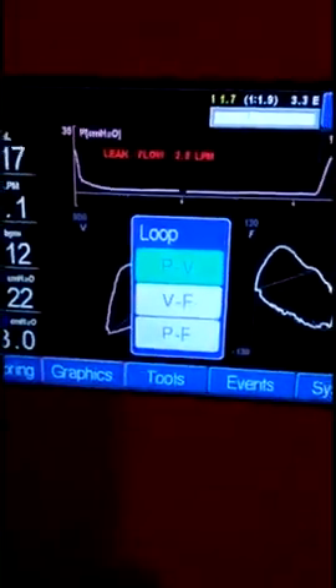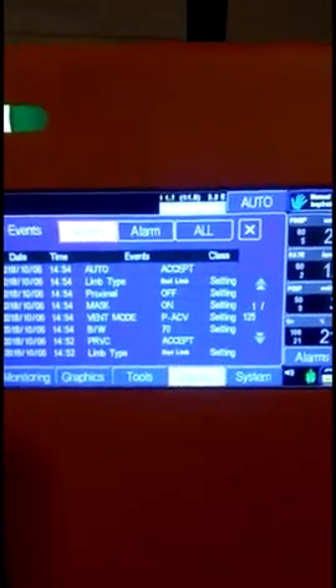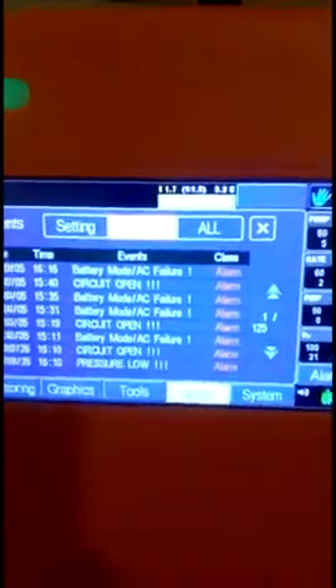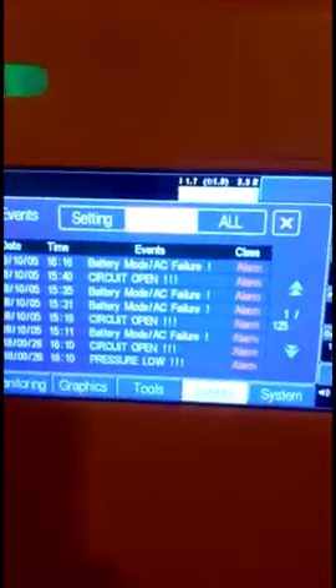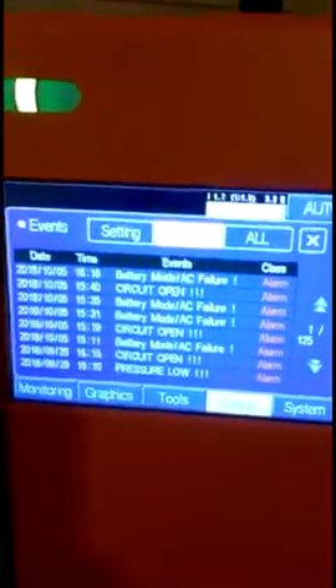This ventilator also has a loops facility. By pressing the layout button, you will get loops as well as a single waveform, and you can select between all three loops as per your requirement. It also has an event log of around 1000 events, so you can see what settings have been applied and what alarms have arrived.